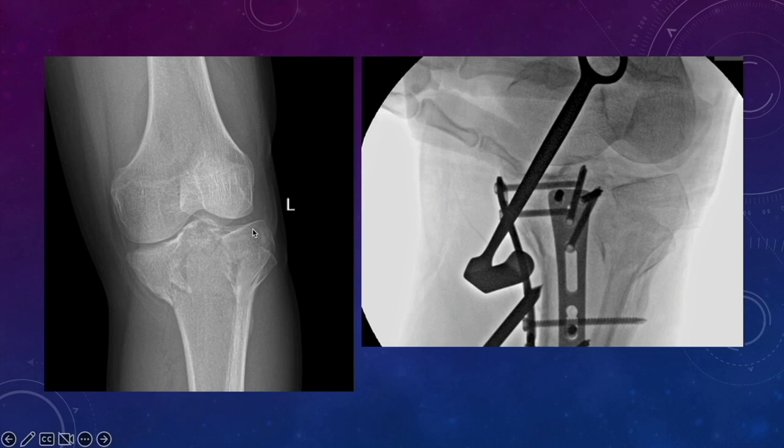it, but you will not be able to lift it properly or reduce the lateral condyle, because for reduction of the lateral condyle, this whole block needs to be reduced. There is not a separate depressed fragment. So if you are using a larger device through the bone fragment, you will not be able to reduce it properly because the device will block the reduction of this lateral condylar fragment.